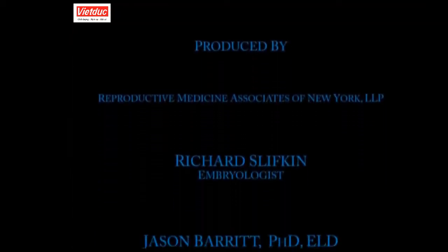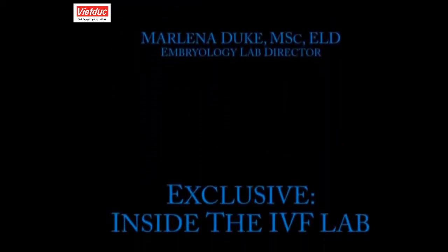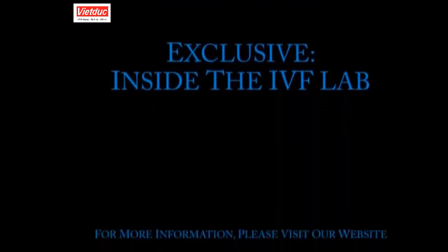We hope you have enjoyed this short tour of our laboratory. The embryologists at RMA of New York take great pride in every procedure and we hope this video helps you understand the care that we put forth in helping you achieve your dreams.